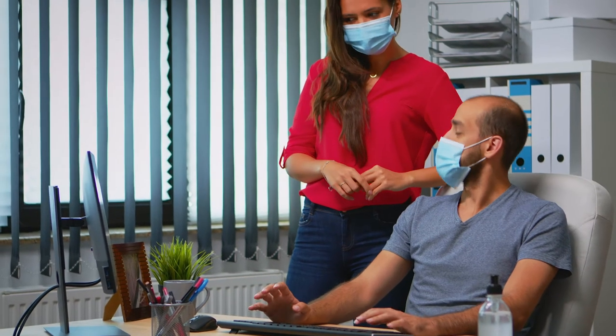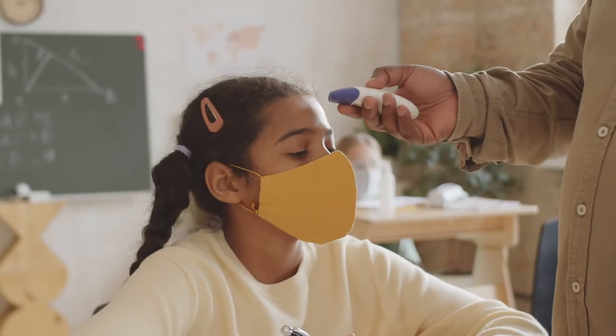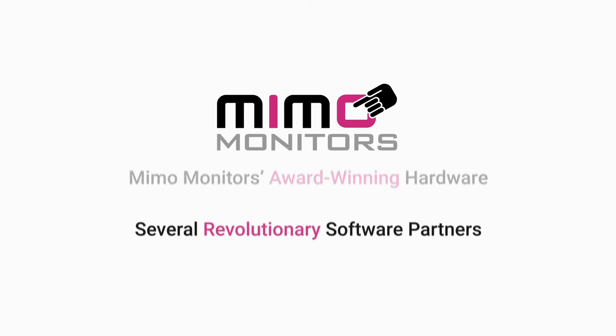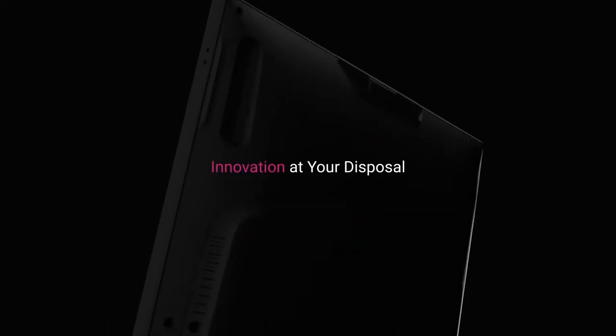As the world marches toward a new normal, temperature scanning solutions can help you stay ahead of the curve and play a vital role in keeping you, your business, and your family safe. By integrating MIMO Monitor's award-winning hardware with several revolutionary software partners, we've crafted a touch-free temperature-taking platform to elevate your safety while ensuring you have innovation at your disposal.